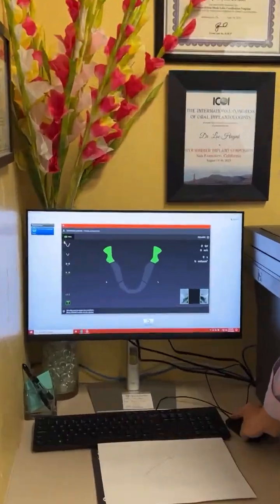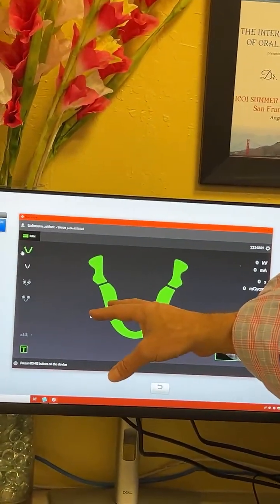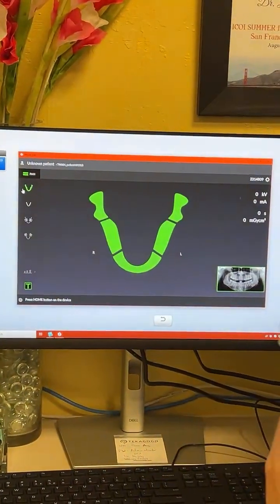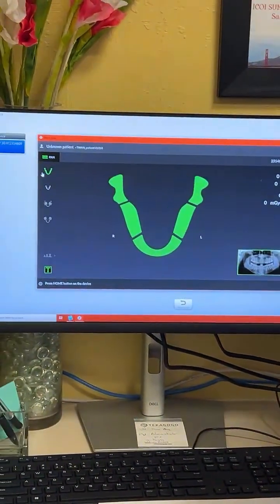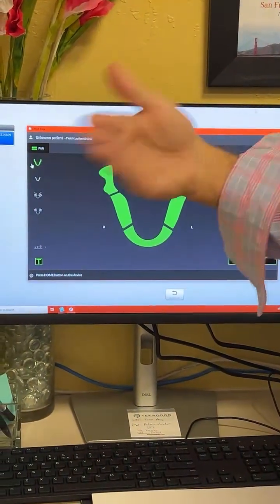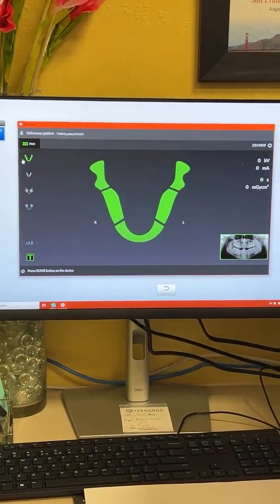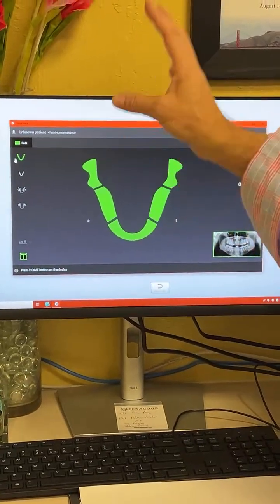I'm going to go back up here to Pano. You wanted to know 3D. So right now, the only option you can take is a pan, because you can't take a 3D into EagleSoft. So if you want to do 3D right now, then we can't go through EagleSoft for the training. Yeah, we want to learn 3D now. So we're not going to go through this way. This would be just for Pano.